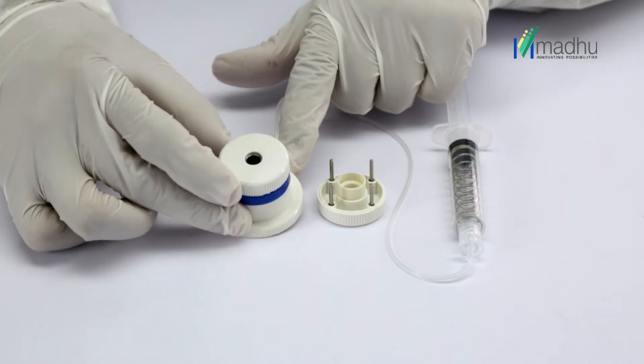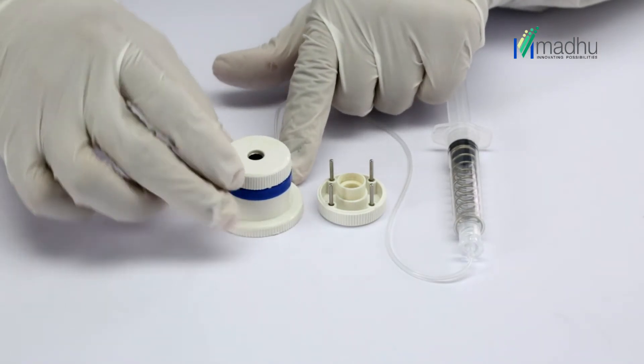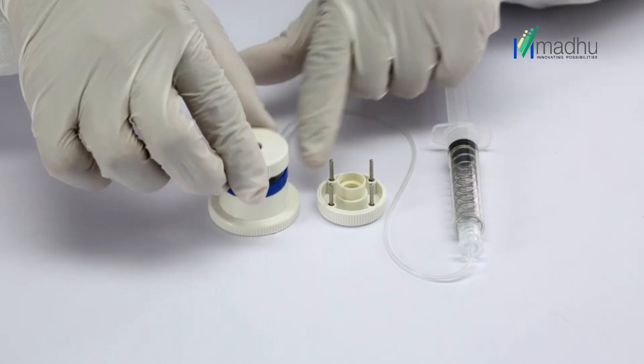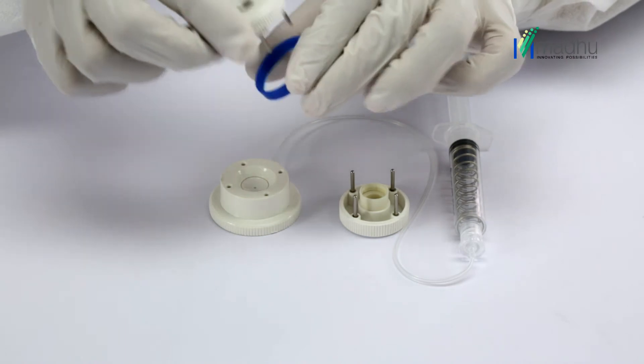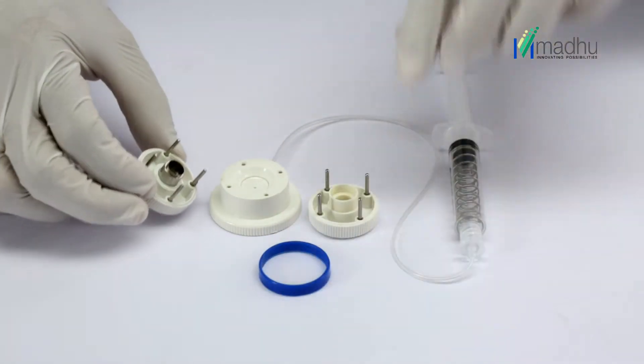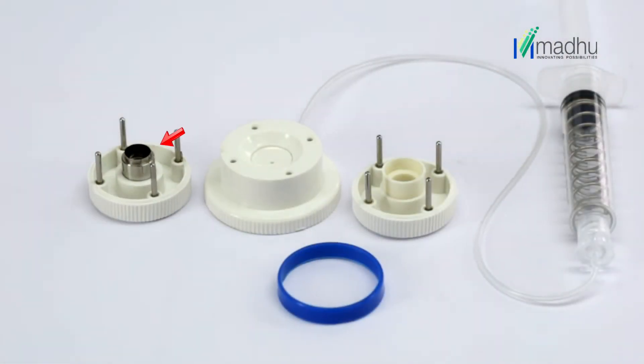Hold the cutting block base with one hand and pull the trephine blade housing upward with the other hand. Turn it over and carefully place it on a sterile tray and discard the blue spacer ring. Again verify the blade diameter which is engraved on the stainless steel trephine.